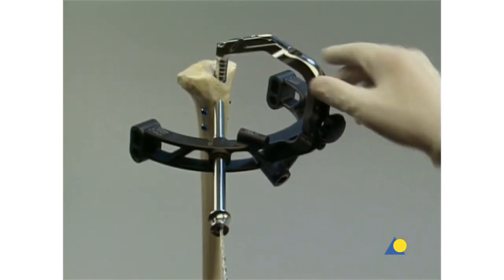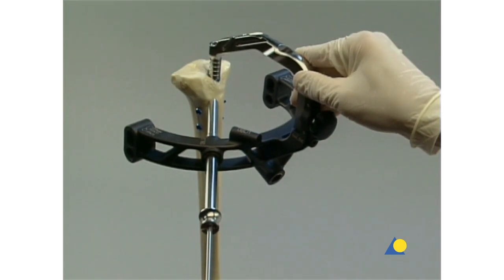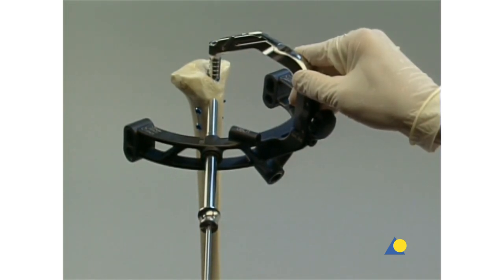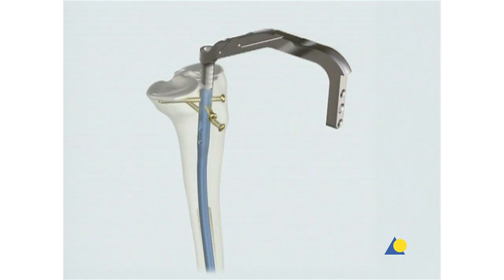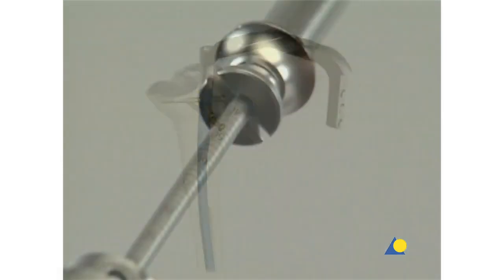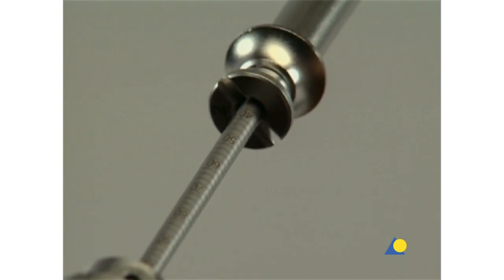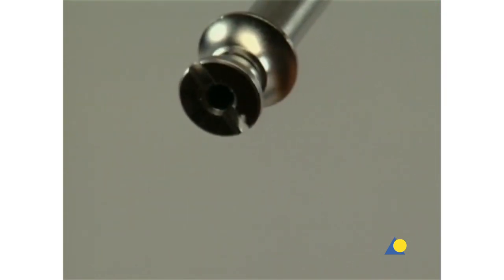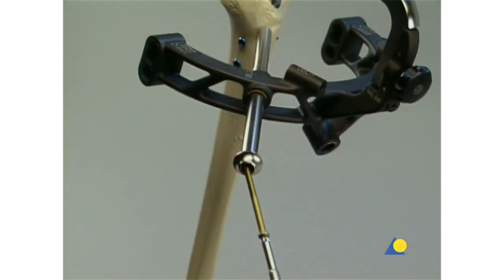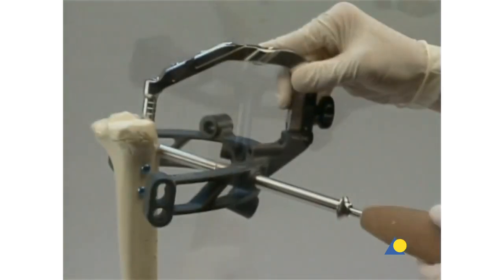The calibrated drill bit is inserted and the near cortex is drilled. Drilling continues, and the penetration through the cancellous bone of the tibial head is controlled with the image intensifier. The longest possible screw should be chosen. The drill bit must not perforate the far cortex, and the tibial plateau must not be damaged. The drill sleeve is pressed firmly against the near cortex, and the measurement is read from the calibrated drill bit. A shorter screw is selected if in doubt. A cancellous bone locking screw of the appropriate length is inserted through the protection sleeve, and these steps are repeated for the other cancellous bone locking screws.